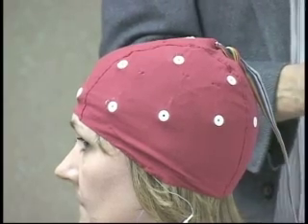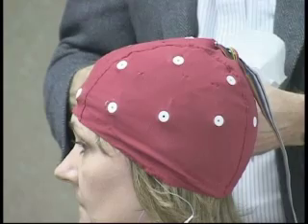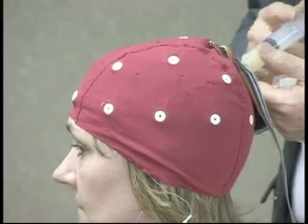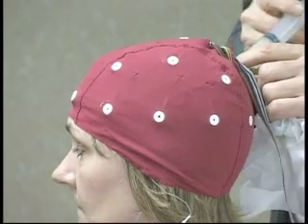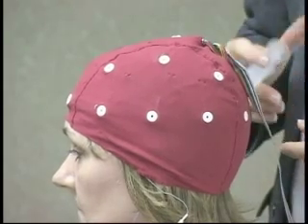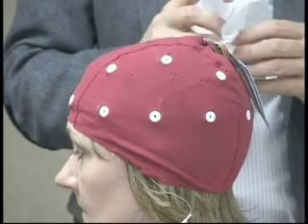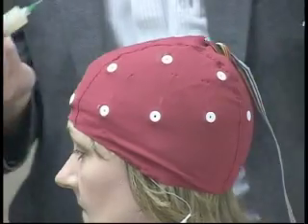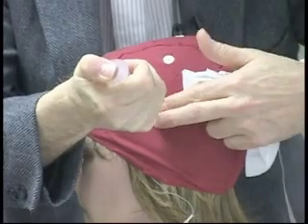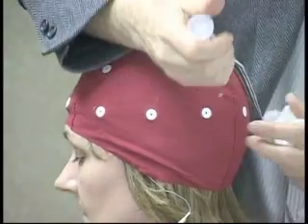Question from the audience: given the sensitivity of Atlantis, could you have that connected to the Atlantis while you do a hookup? You could have it connected to the Atlantis while you do a hookup. One of the things I do is I just run through filling this up and I let it sink in — kind of saturate it in the scalp — and that helps make a connection. Give it time, don't rush this process. You want this fluid to get into the hairs and into the scalp as much as possible so that you don't have to start drilling down to try to get a good connection. Another reason for pushing down is that it helps you from putting too much fluid in and it draining all around the sites.